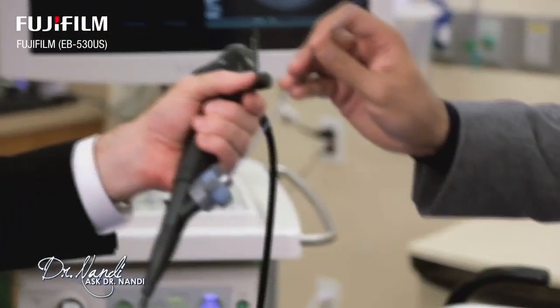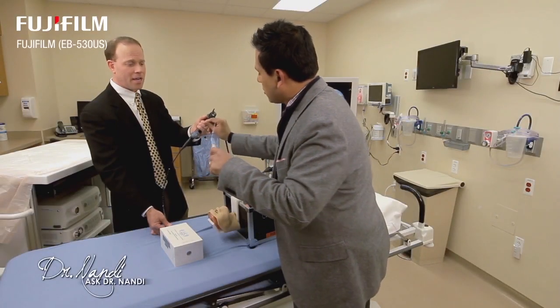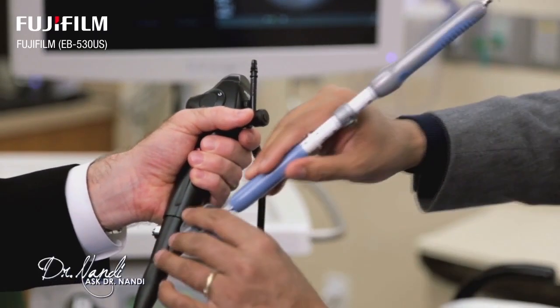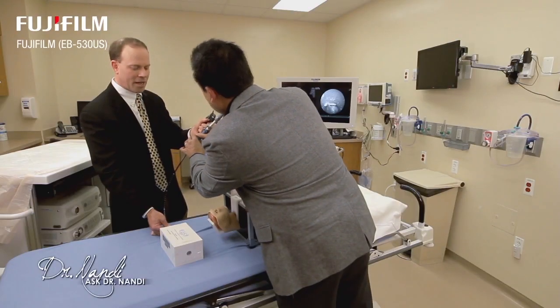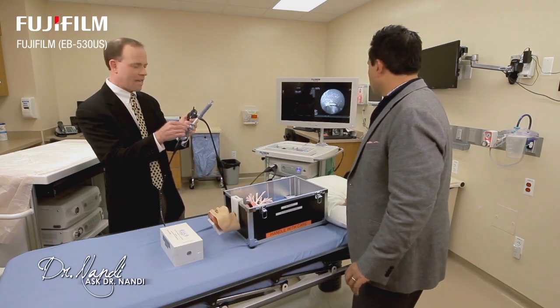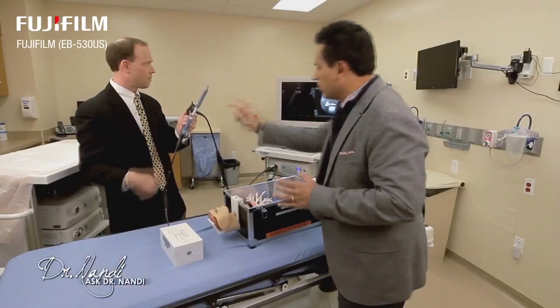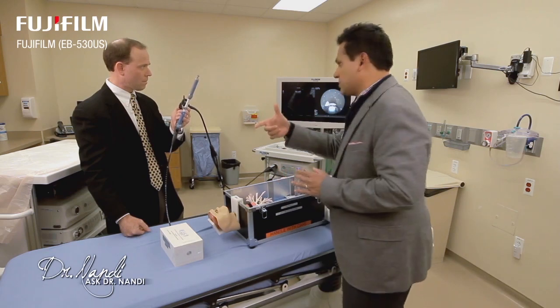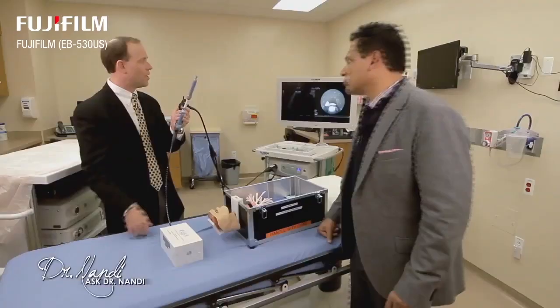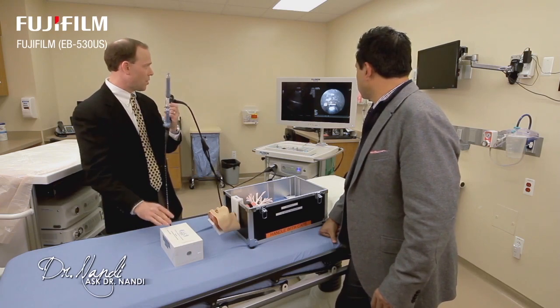Sure. Can I help you? Yeah, absolutely, please. So the biopsy is really with a needle aspiration, and Dr. Nandi's inserting the sheath inside of the working channel of the bronchoscope and securing it in place. Okay. And then at the end of the scope, you can usually see the catheter sheath come out. There it is. There you go. And so you're having this go through the inside of the scope and come out and take a sample. That's right. And the catheter sheath is just a piece of plastic that protects the scope from the needle. So we want to make sure that the needle is completely outside of the scope. And then we want to find our lymph node again.